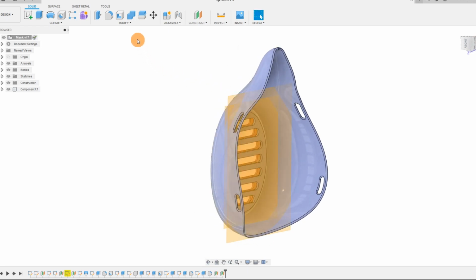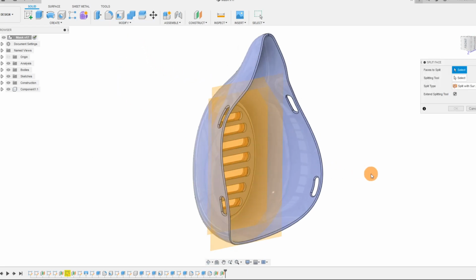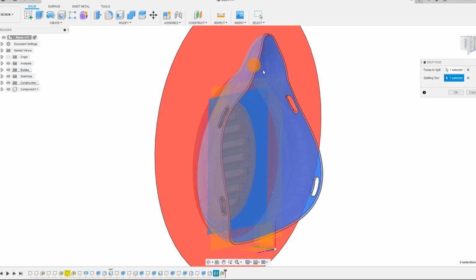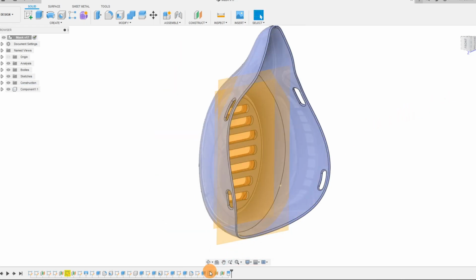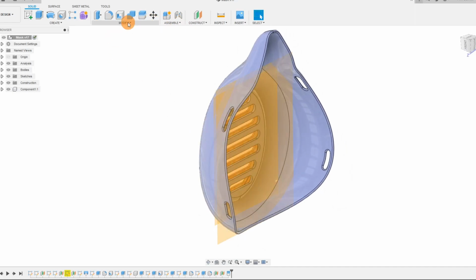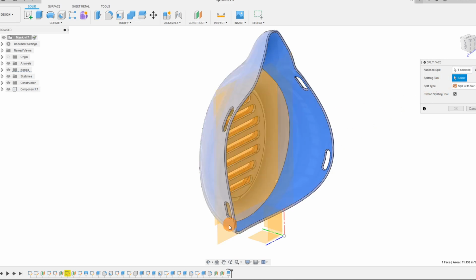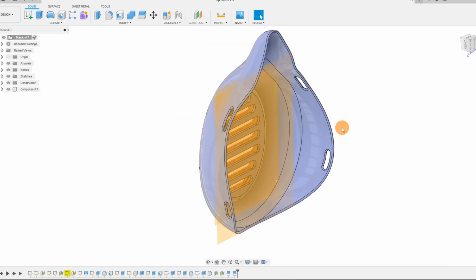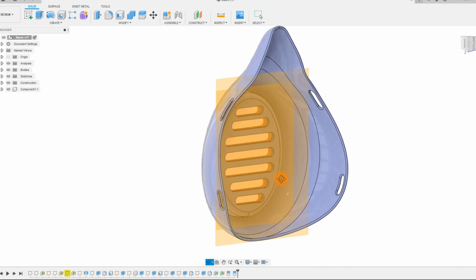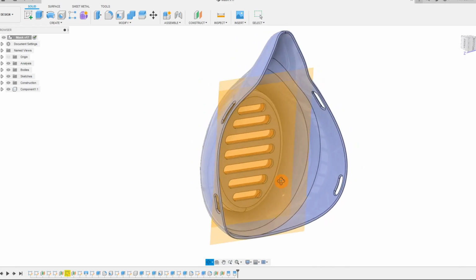And what we wanna do now is come up to Modify, Split Face, and I'm going to select this interface. And for my split tool, I'm going to select this plane, and I'm gonna hit OK. And as you can see, it split our interface. And I'm gonna do the same thing on this other one. So I'm gonna come to Modify, Split Face, click this face to split. And this is our splitting tool right here. I'm gonna hit OK. And as you can see, we now have a place to have the gasket.